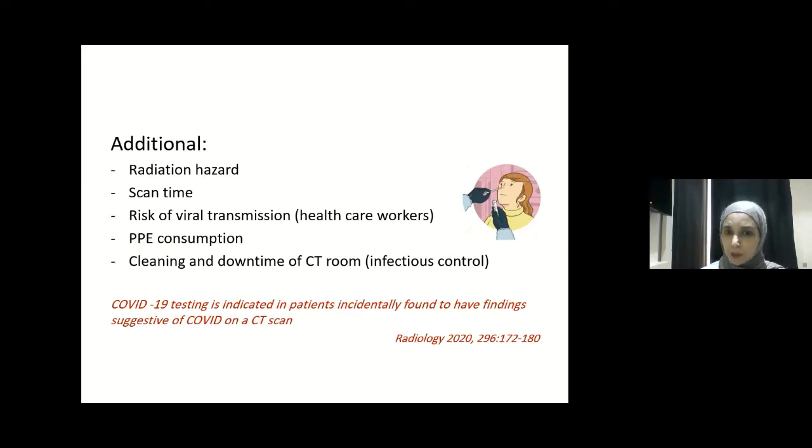while moving the patient through the healthcare institutes, and this might affect the healthcare worker plus the patient, other patients as well. Personal protective equipment consumption has a limitation, and cleaning and downtime of the CT room according to infection control guidelines and policy may take around 1 hour while we are scanning the patients. Plus, COVID-19 testing is a must, even if we saw any suspected finding on imaging related to COVID-19.